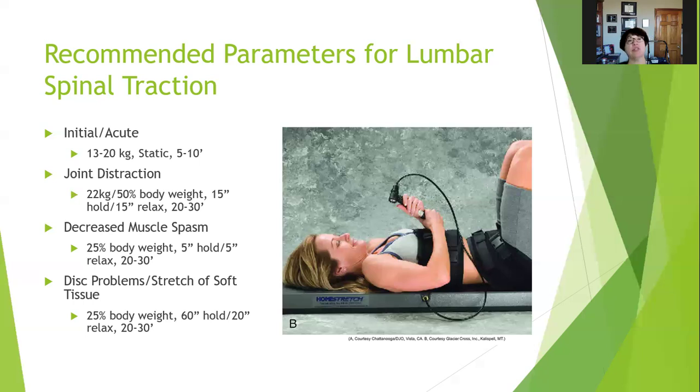So the first treatment you do static for a short time, and then if they respond well to that, the second treatment you're going to do, depending on what you're trying to treat, what the indication is, you're going to do different amounts of pull and different on-off times.